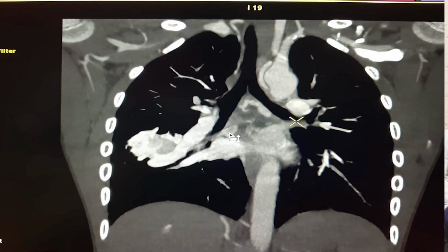You had the child also. And we had another interesting case. Dr. Sudhir referred the case to us: the patient, a 10-year-old child, had a huge AVM on the right lower lobe. There were too many arteries supplying that AVM. We had a discussion, and Dr. Sudhir thought there were multiple arteries, too big and too tortuous, so it was not possible to embolize.